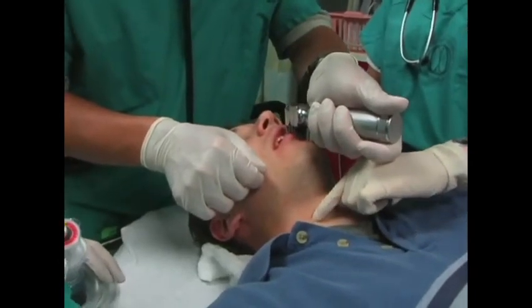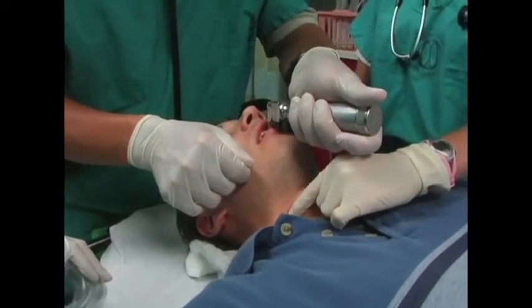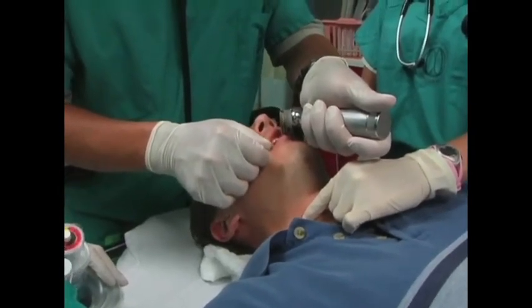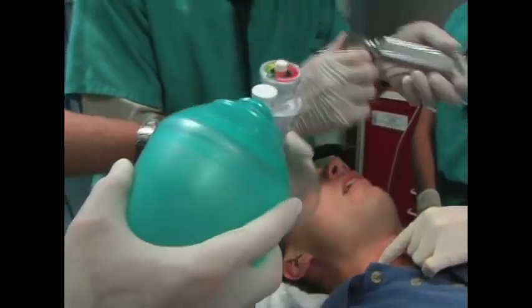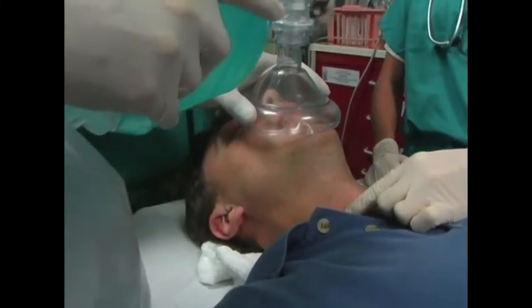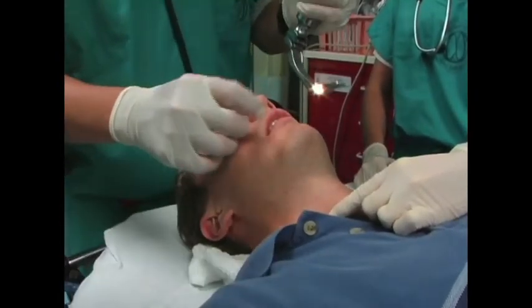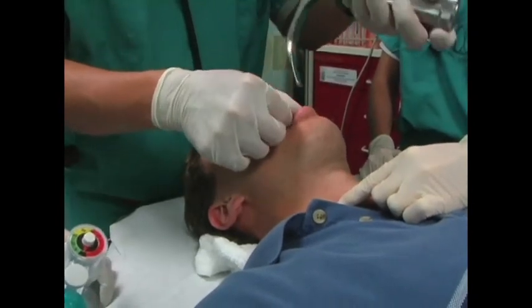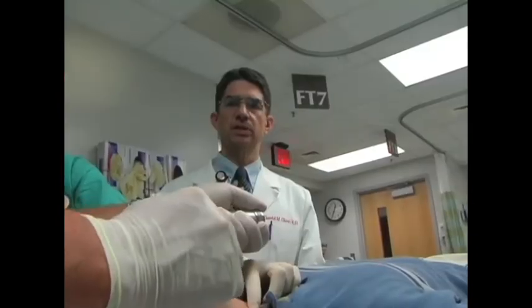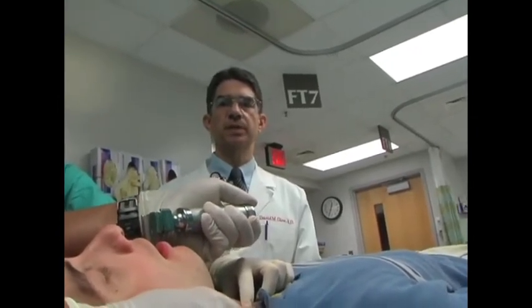If you are unable to visualize the vocal cords, the burp maneuver may be utilized. This procedure entails manipulation of the thyroid cartilage using backwards, upwards, rightwards pressure, which may bring the cords into view. If unsuccessful, reoxygenation may be required utilizing the bag valve mask device. The operator may consider changing the blade, the tube size, or repositioning the patient prior to further attempts at intubation. Three unsuccessful intubation attempts define a failed airway. Further rescue techniques must be considered at this point.